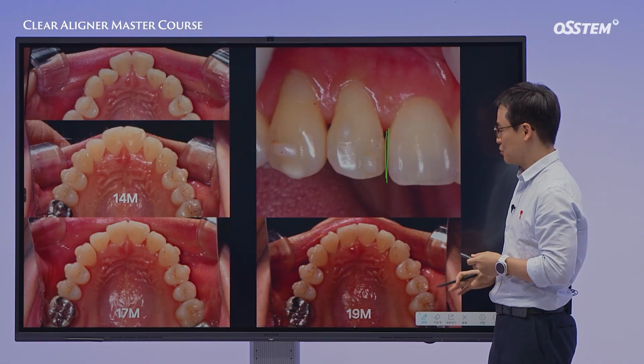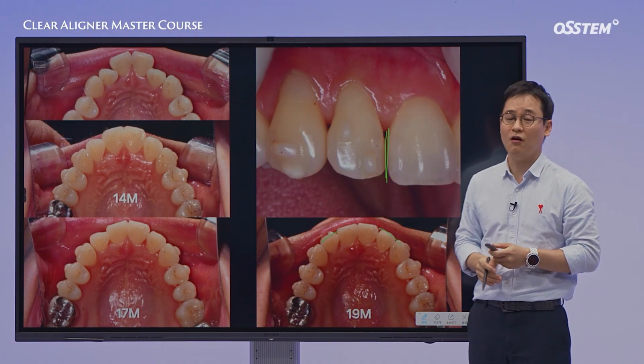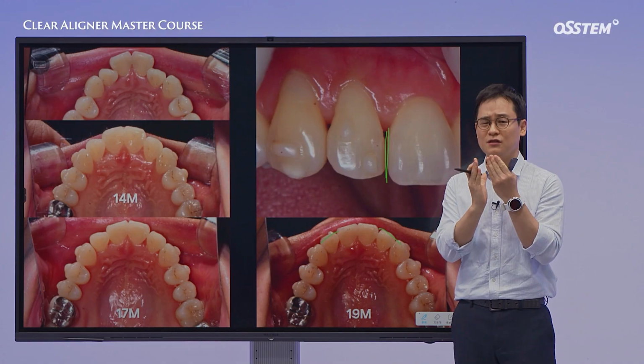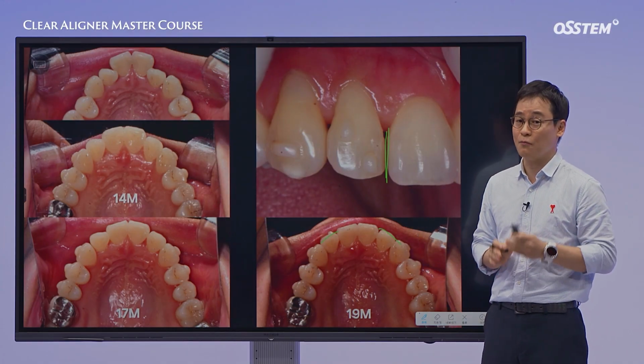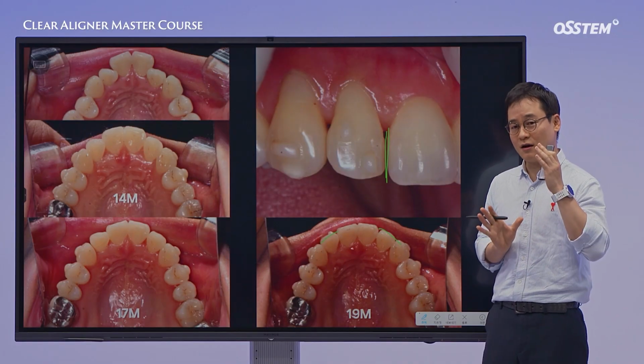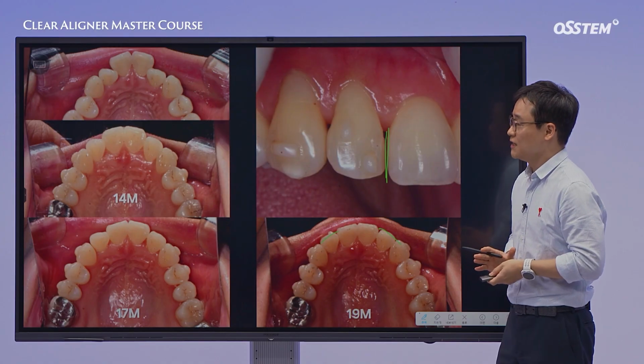When this happens, we need to check whether the necessary space is available. Once we replan the case, movement often improves, so it's crucial to confirm that there is enough space for the tooth to move. Whenever a problem occurs, I recommend securing that space before making the next aligner.